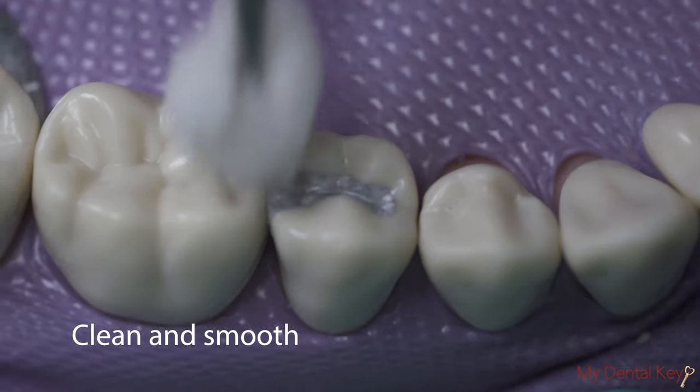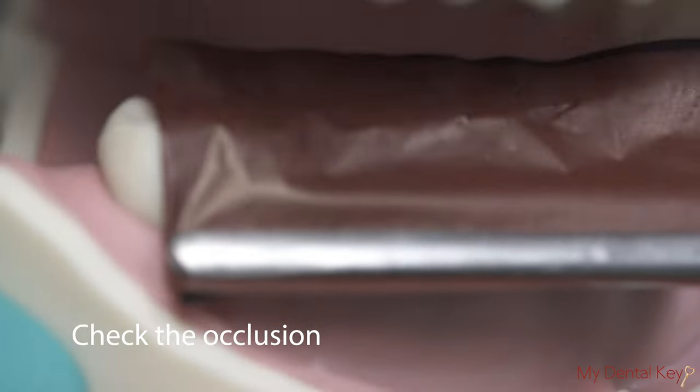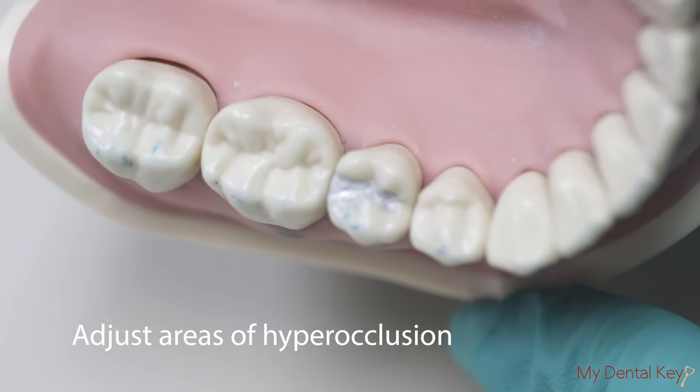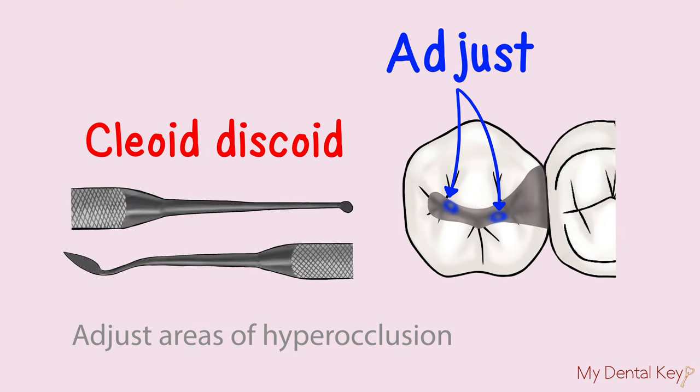Clean and smooth the surface of the restoration with a wet cotton pellet. Remove the isolation. Using articulating paper, check the occlusion. Areas that need to be adjusted will mark heavily with the articulating paper. Adjust these areas where the restoration is high using your amalgam carver or cleoid discoid.